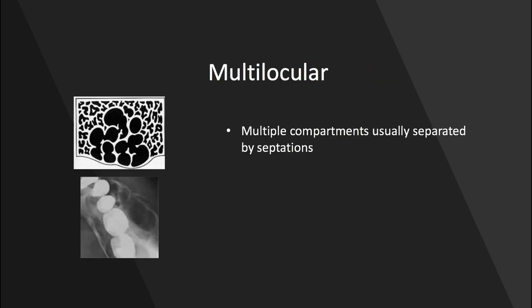We can also have a multi-locular radiolucency. This time, there are multiple compartments, and they're usually separated by these thin radiopaque septations. This is a great example of a multi-locular radiolucency.